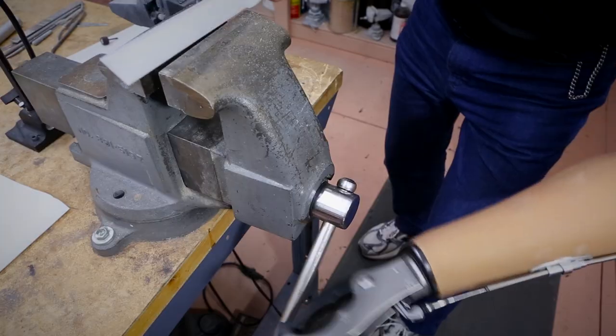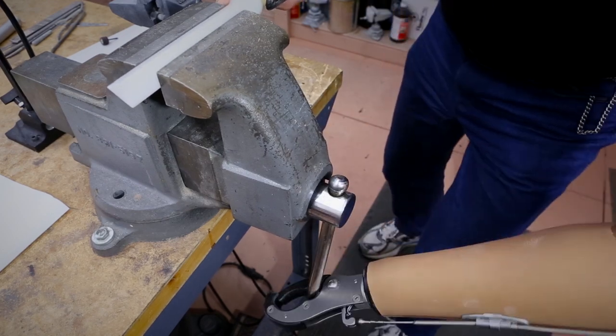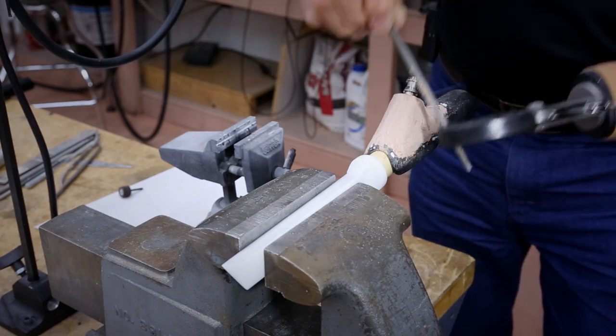I'm working on a model here. This is a pattern that eventually we're going to make and utilize and make into a tool, but this is just to illustrate the bilateral capability of using a voluntary closing device.